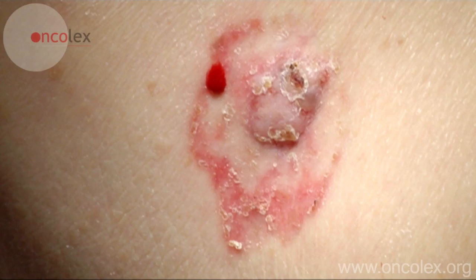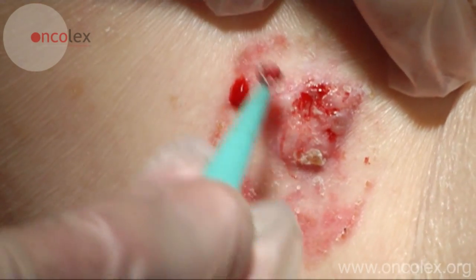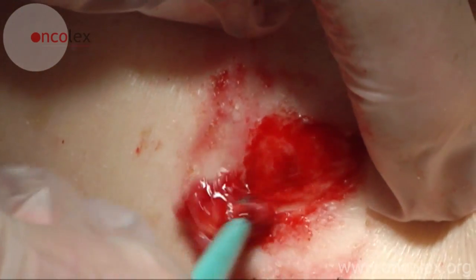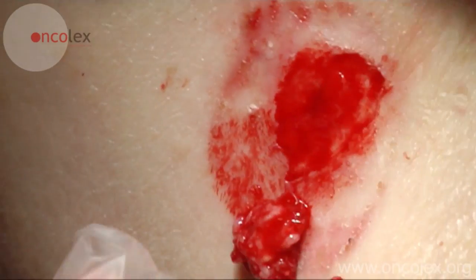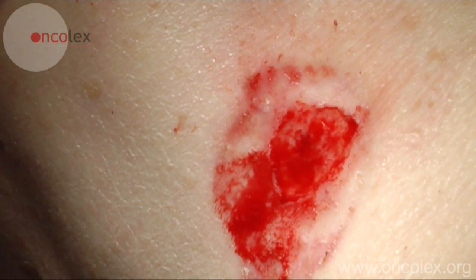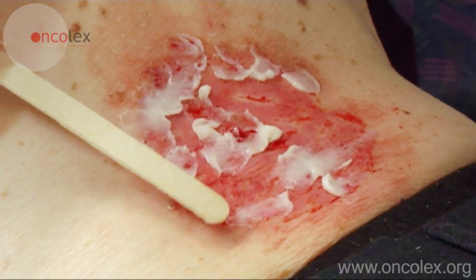The lesion appears as a raised polyp-like skin abnormality. By scraping, the tumor characteristically comes off in one piece. The cream is then applied to the lesion and it is covered.